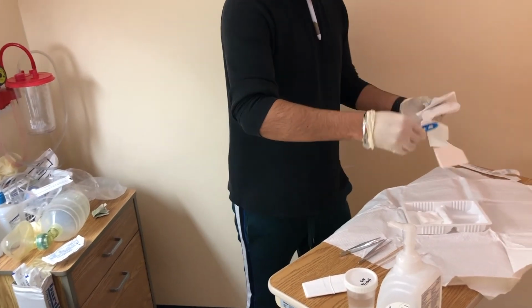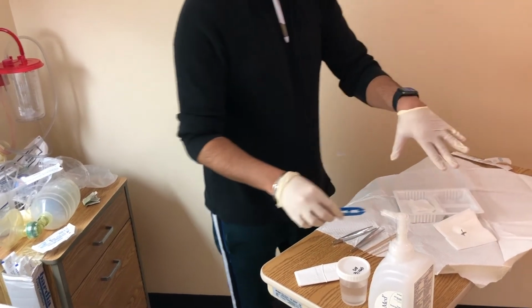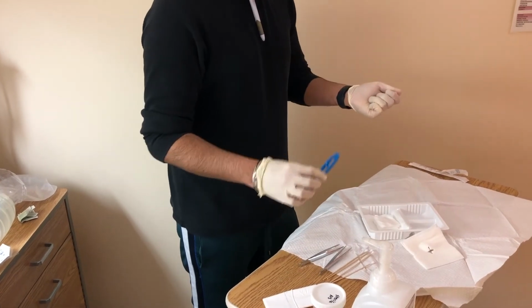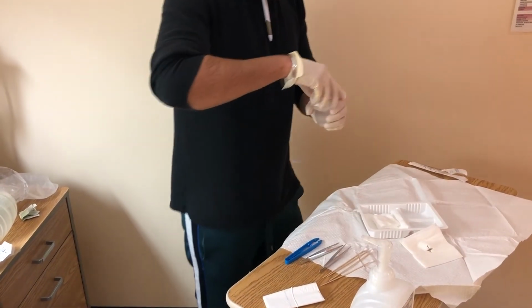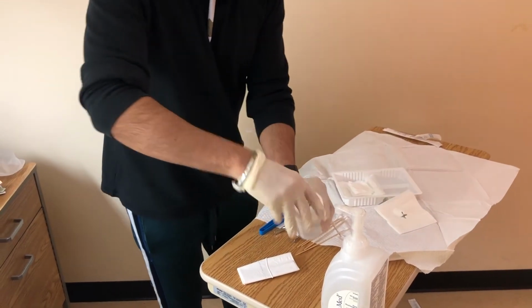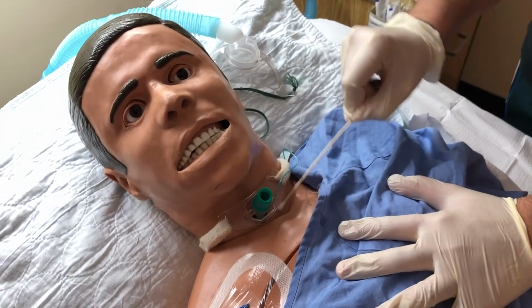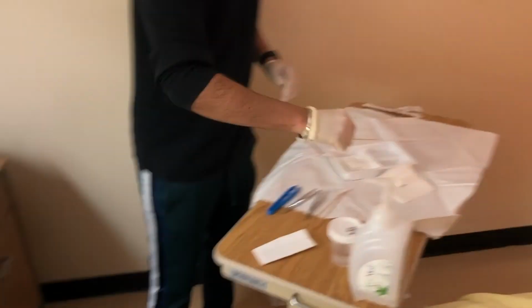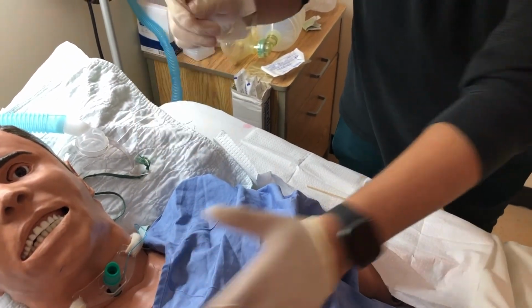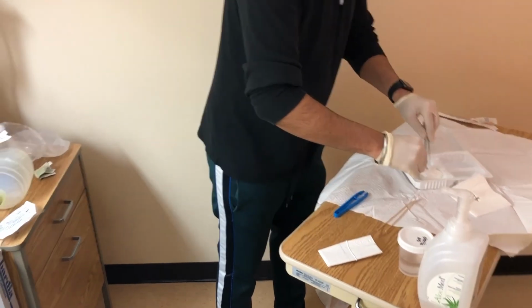So what I want to start off with is, if that touched the 2-inch border, I would get a new one and put it in. For this case, say I only have one, so I would reopen it and then put it in. I also want to put sterile normal saline in here. Good. And we can start the cleaning. So I would get my swabs, make sure it's dry, do one swipe underneath, discard. Another one, dry it, swab, discard. And then I could make rosettes with this.